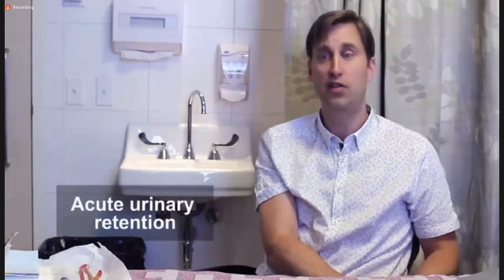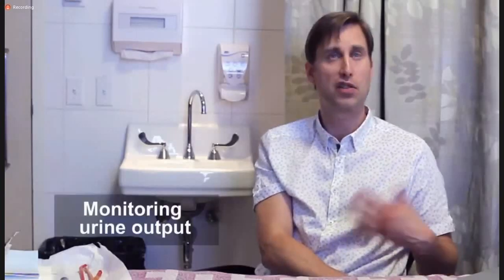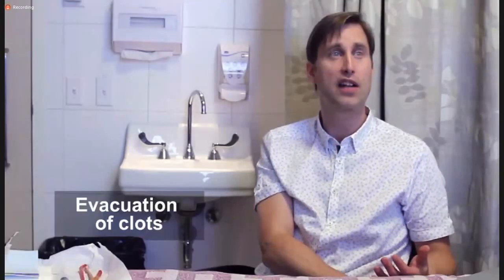So in these instances, the patient's very uncomfortable, the bladder is full, and we place a catheter in order to empty the bladder efficiently. The other reason we put a catheter in is for people to have monitoring of their urine output. And that is usually closely associated with the degree of perfusion in their body. So measuring urine output can give you a very good idea of the status of someone's hydration and their overall volume status. The third reason that mostly we urologists put catheters in is for the purpose of evacuating clots and blood from the lower urinary tract.